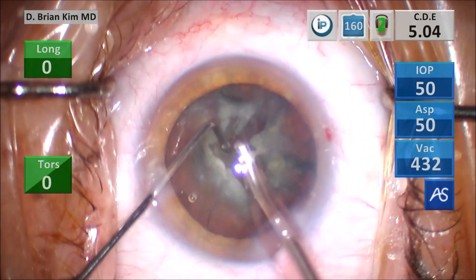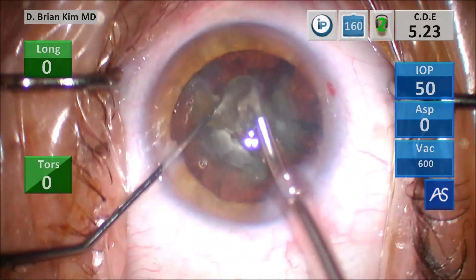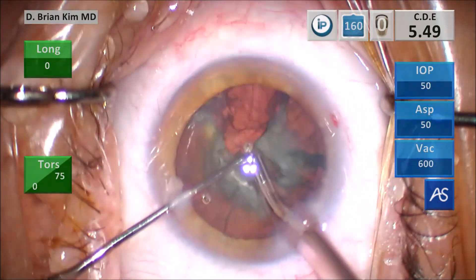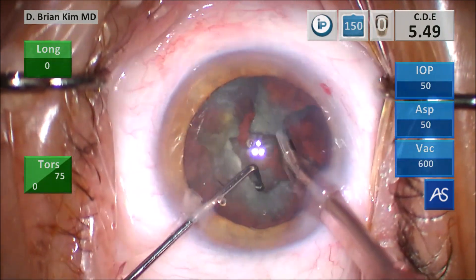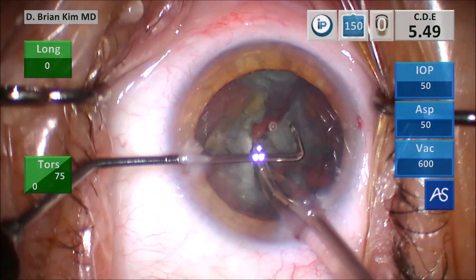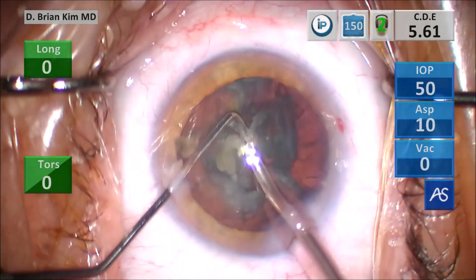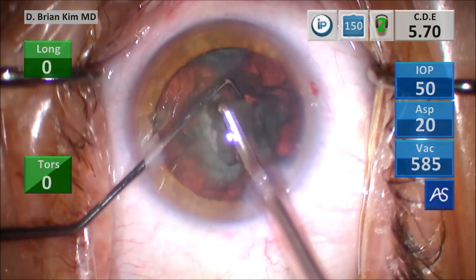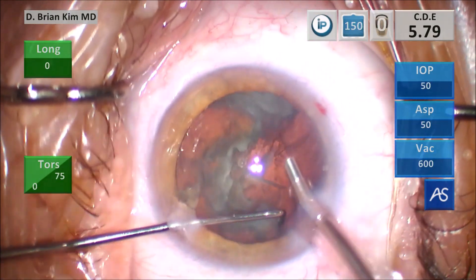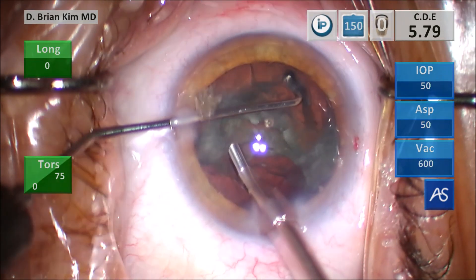I break that first quadrant into smaller and smaller pieces and then emulsify the lens piece. It's very important when dealing with cases of zonular weakness not to put any additional traction on the zonules. I separate the second quadrant from the rest of the lens. It's just a little loose, so I use some vacuum to gobble it up. Very carefully turning the lens — you only want to turn it when it easily turns. You don't want to apply unnecessary stress on the zonules if the lens doesn't want to turn.